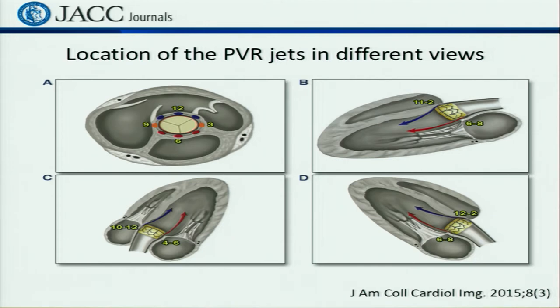So there's well-documented cases even in this lab where the transthoracic and the transesophageal gave very different answers to the same question. And it's not because one missed it, one was right, one was wrong, or the clinical challenge of, is this PVL new? Did it just happen? Did the valve move? More often than not, it's just recognizing there's a very real shadow effect on a transthoracic that's the opposite on a TE, and vice versa. TEs can miss things, and then they show up on a transthoracic.